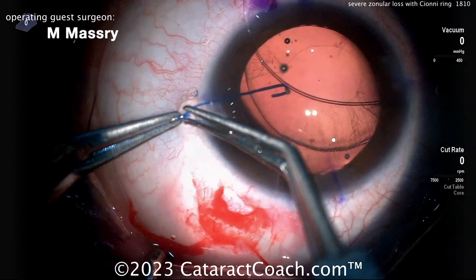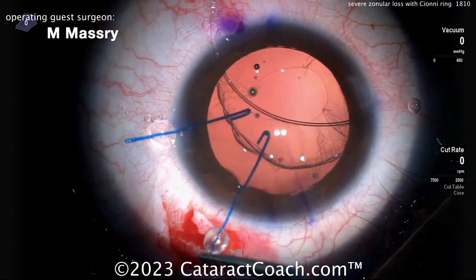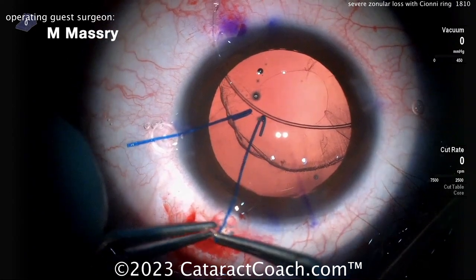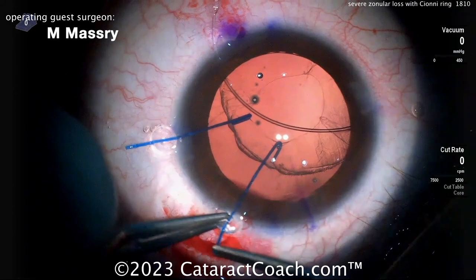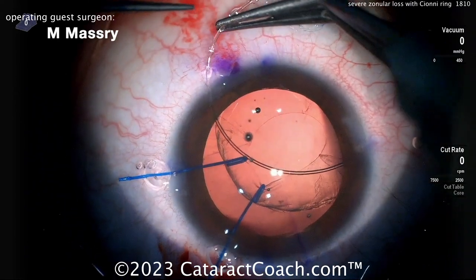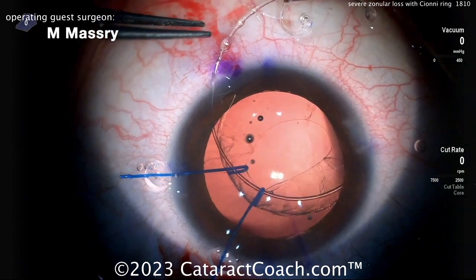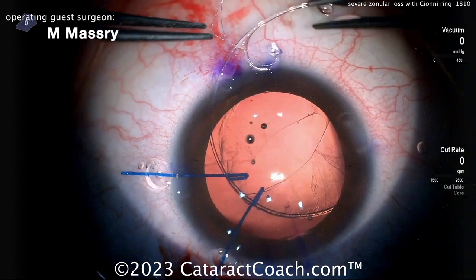Now it looks like an iris hook or a capsule hook being used, and that's going to help support the capsular rhexis edge. These look like iris hooks — there are also available capsular hooks, which are a little more gentle. They're angled a little differently and have a broader area of support under the capsular rim. Advancing that around, taking your time.